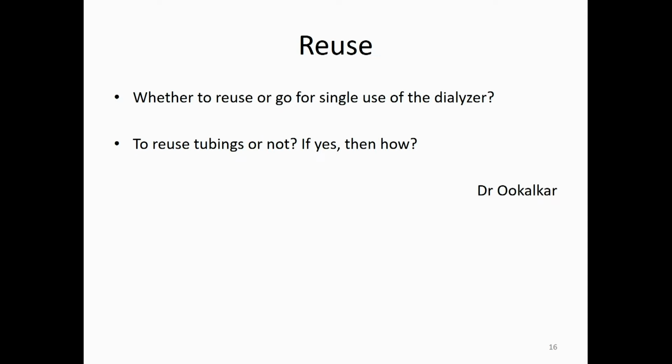But the reason we kept it at 12 is that patients, talking to each other, started complaining, "Arey, uska 15 use hua. Why are you throwing my dialyzer?" So what I propose to do is to take them to the reuse area and show them the reuse, and then show them the Excel sheet of Kt/V per reuse. Because unless we do it, with the resource constraints that we have, it will be impossible to operate a dialysis unit.